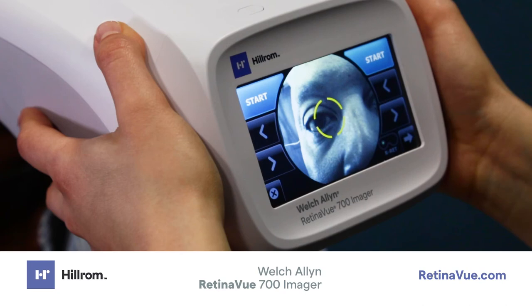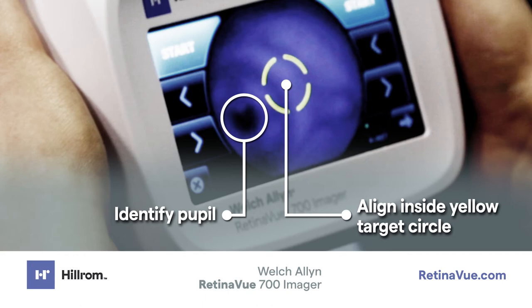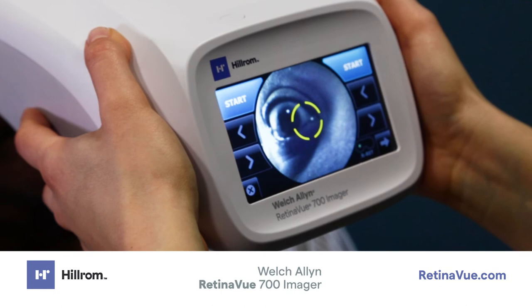Acquiring an Image. While moving toward the patient, align the patient's pupil to the yellow alignment circle using the live video screen. If the pupil is located above or below the yellow circle, pull the imager slightly away from the patient and realign the pupil to the yellow circle.